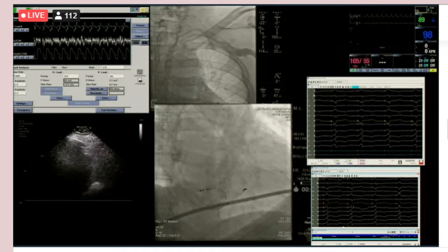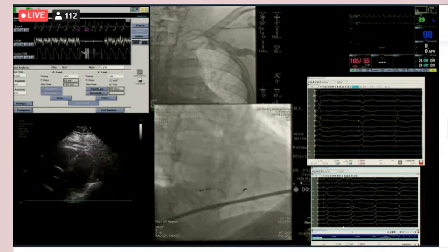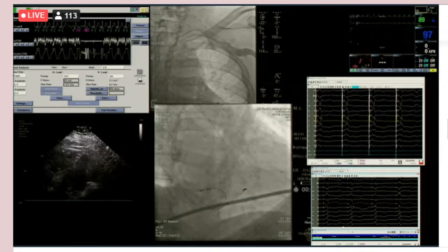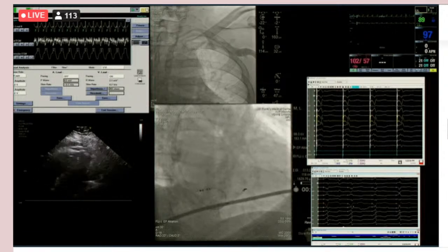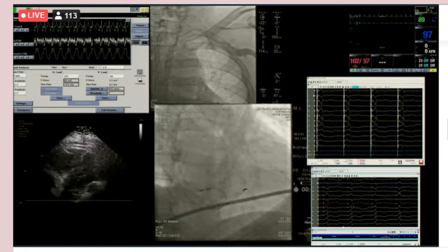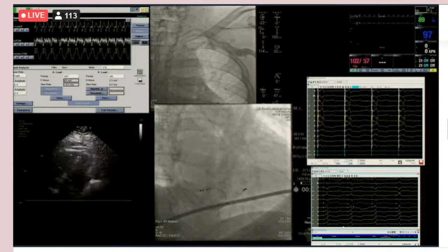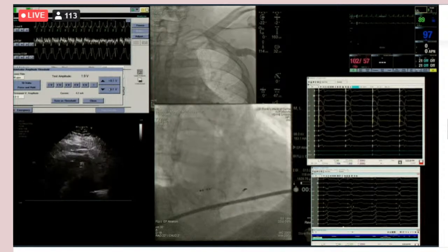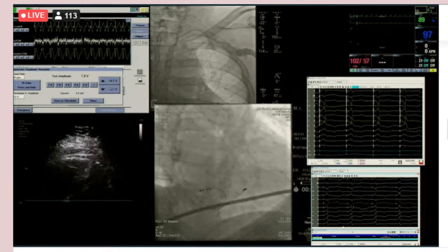Now you can potentially just pace this unipolar, you know. Is there any circumstance where you just put in the atrial lead and kind of wait on this, give it time? Yeah, that's probably what I'll do. I prefer the morphology with the unipolar, and as long as we have a pacemaker capable of pacing unipolar, then we're okay with that. Now our impedance was right at the edge of 500, so I'll definitely want to use the ultrasound, take advantage of the fact that the ultrasound, make sure we step and make sure we're not in the ventricle. 2 volts. Still 470, 460 or so. It's getting better. There's 1.7, 1.6.